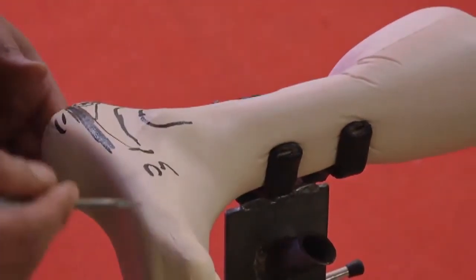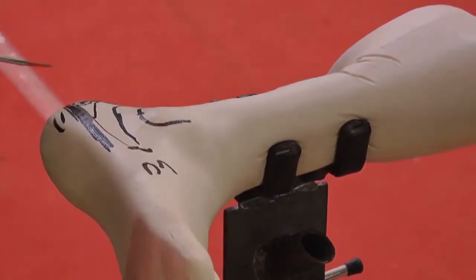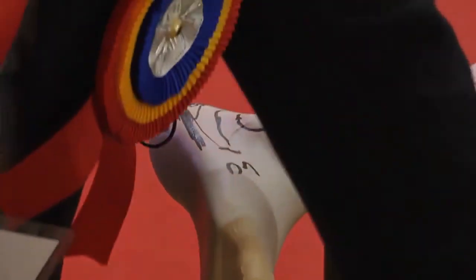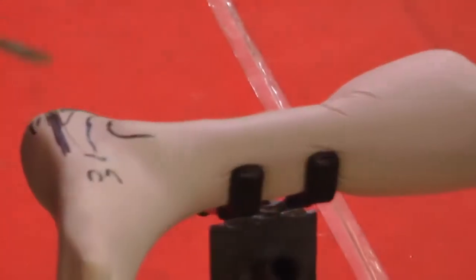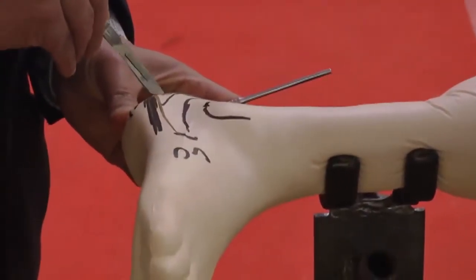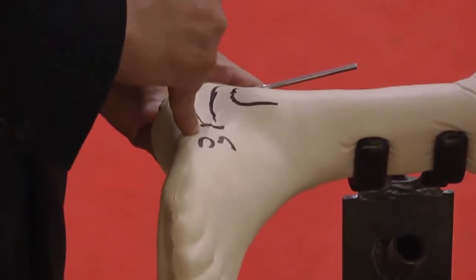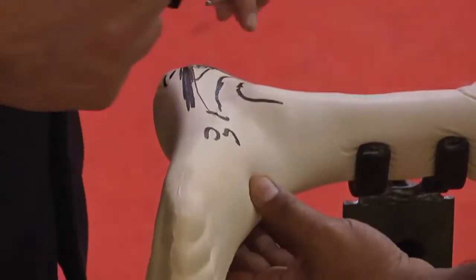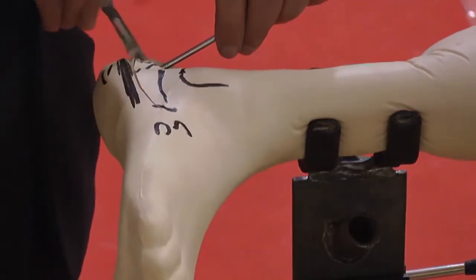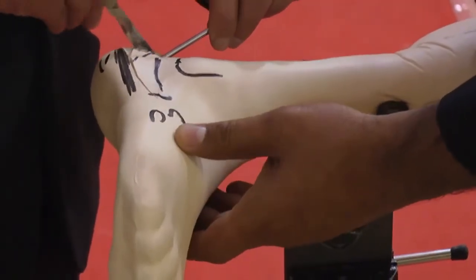So do we have a forceps? So we don't have forceps, and possibly we don't have retractors. So I'm going to use something or the other. So hopefully, now this is not to be done. But no hooks, no forceps holding the flap. So I'm trying to go deep. I don't have the proper instrumentation to hold the flap there.